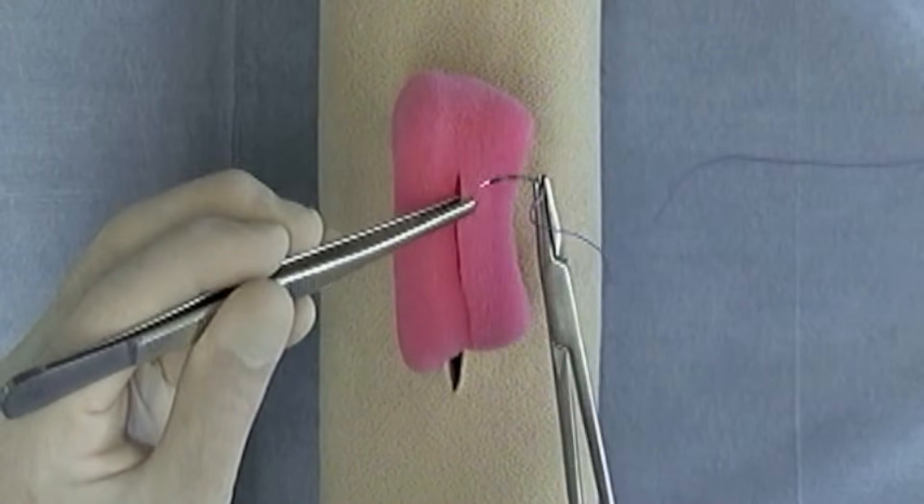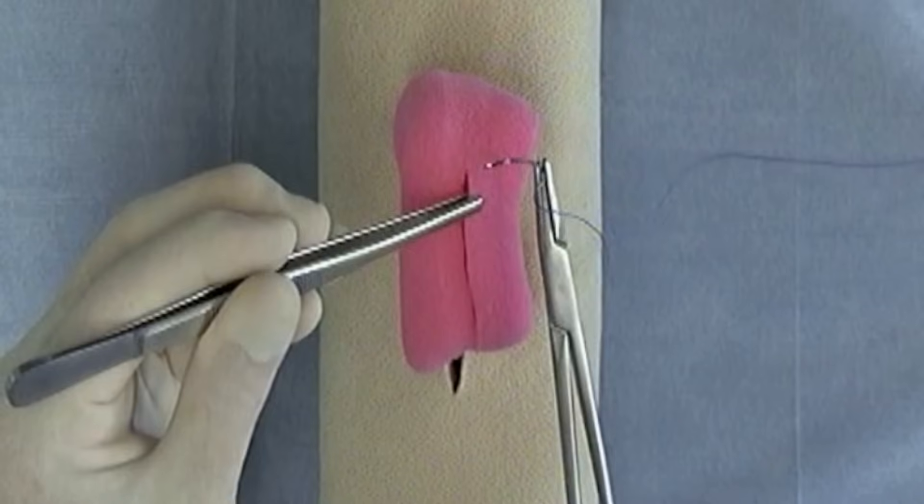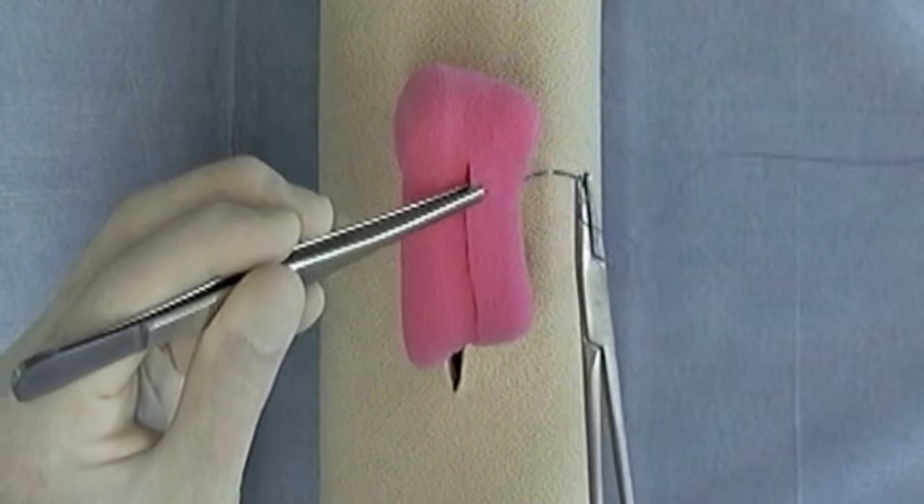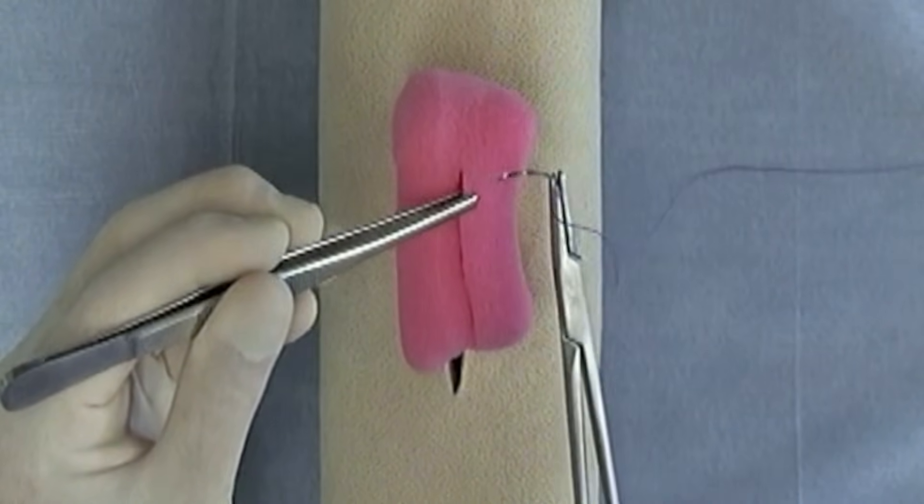Here, I'm going to perform a Lembert at the beginning, and I'm going to tie, and then we're going to perform a continuous Lembert suture pattern.